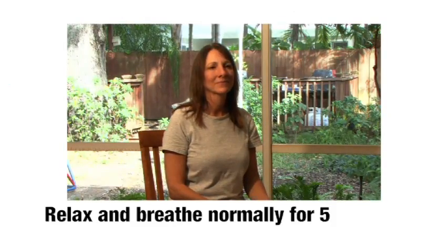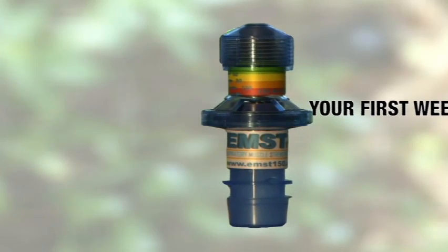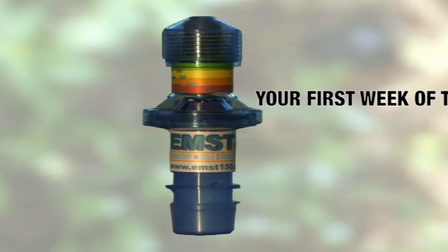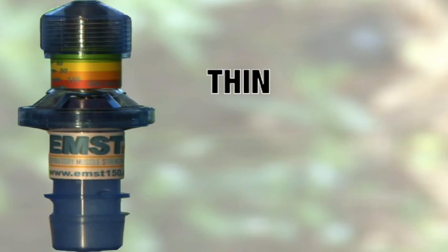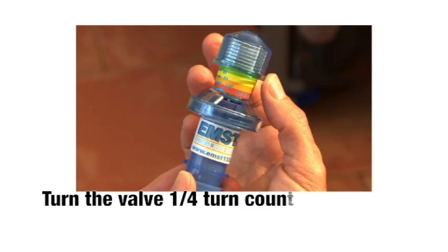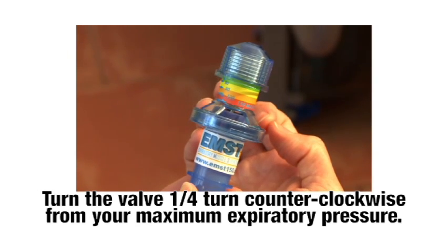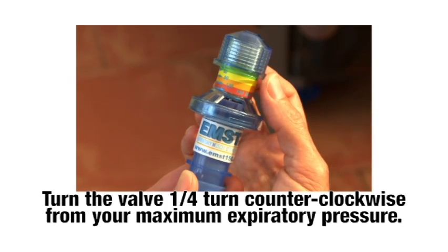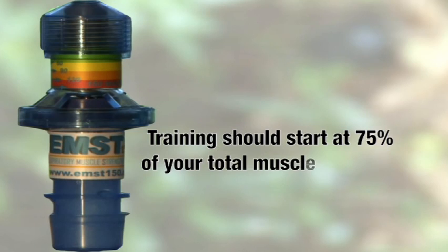Now breathe normally for about 5 minutes to let your expiratory muscles recover. Now that you have determined your maximum expiratory strength, you are ready to start your first week of training. Think 5. To begin, you are going to turn the knob one quarter turn counter-clockwise from where you determined your maximum expiratory strength level. The reason we ask you to do this is because we want to start training your muscles at about 75% of your maximum strength.